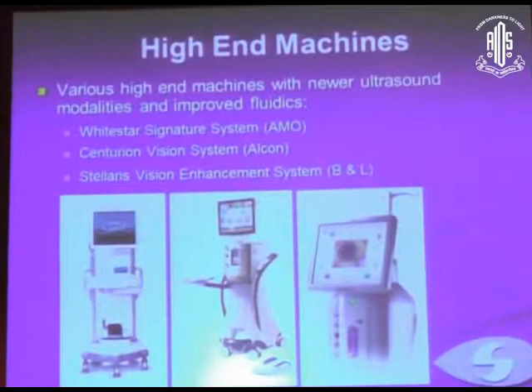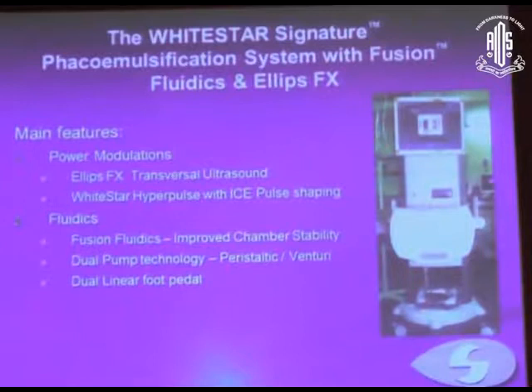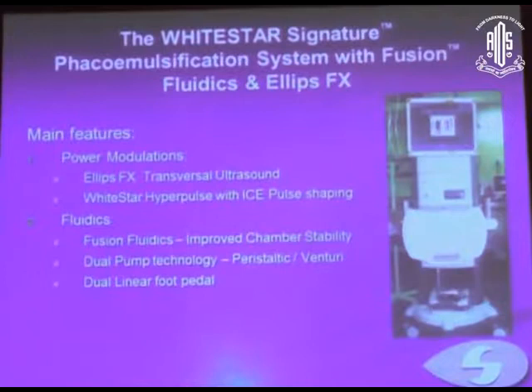Now, the main thing about the power modulation in the White Star Signature System is the ELLIPS transversal ultrasound. And the fluidics has been mentioned already by Dr. Kanslal and Dr. Shah, fluidics. The dual pump technology, that is, it has both a peristaltic and a venturi pump, and a dual linear foot pedal.